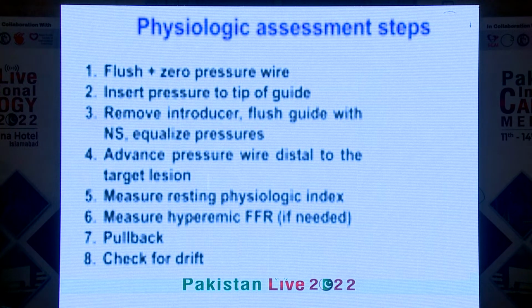And then make sure, this is a very important step, that you pull back the wire after doing your measurements across the lesion to check for drift. Because drift can happen in some cases, innate issues with the wire itself or some technical error that you may have made. So what it means is that you pull back the wire, the transducer portion of the wire, back into the guide tip, and the pressures should still be equal as they were before you inserted the wire forward. And if they're not, then you need to equalize again and reinsert the wire again.